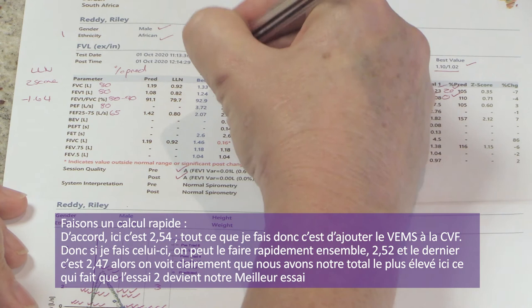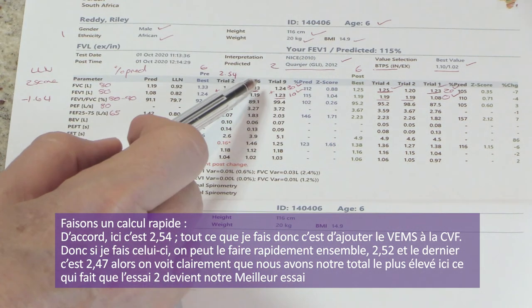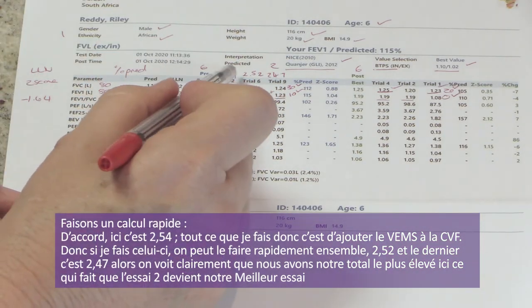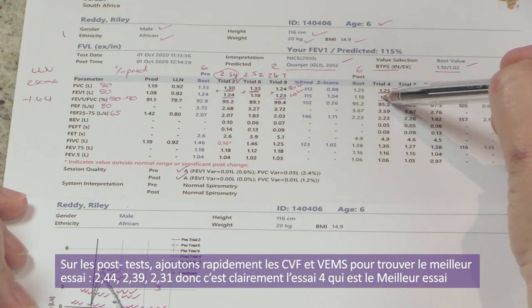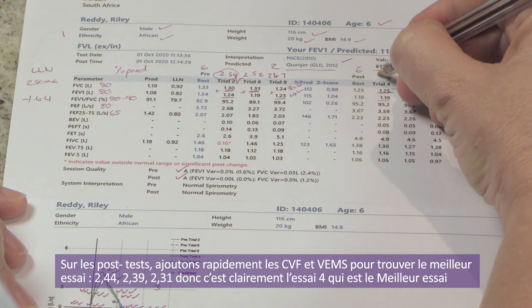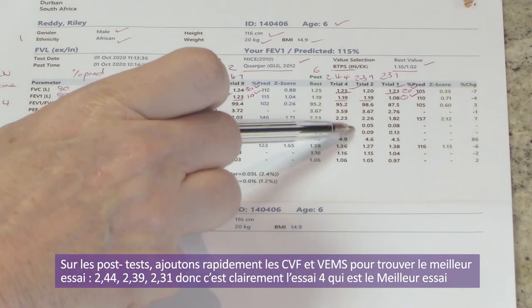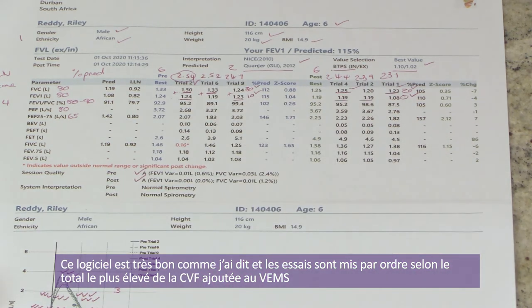Step six: choosing data from the best test. Adding FVC and FEV1 from each pre trial gives 2.54, 2.52, and 2.47 — so trial two is the best trial. For the post, adding FVC and FEV1 gives 2.44, 2.39, and 2.31 — trial four is the best. The software orders the trials for you based on highest sum of FVC and FEV1. Step seven, interpretation: no concavity on the downward curve suggesting obstruction, and no loss of volume indicating restriction.